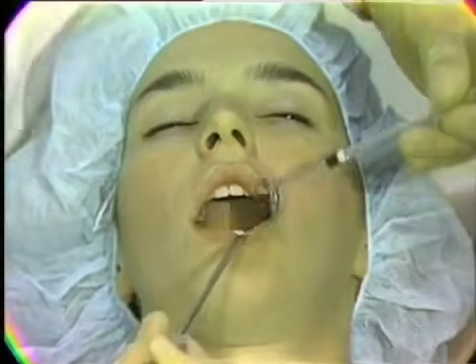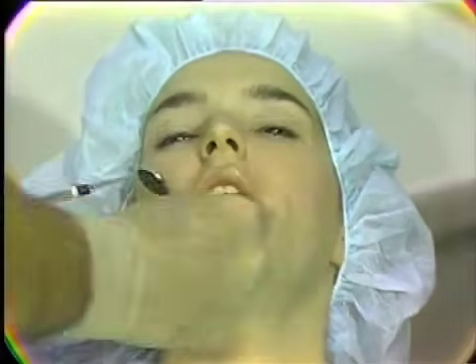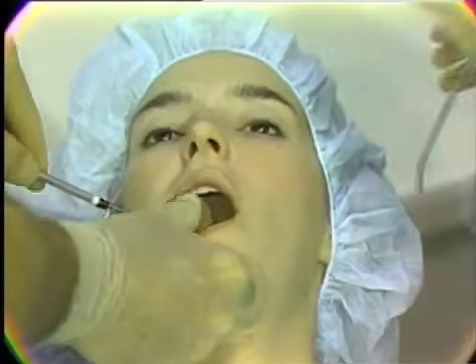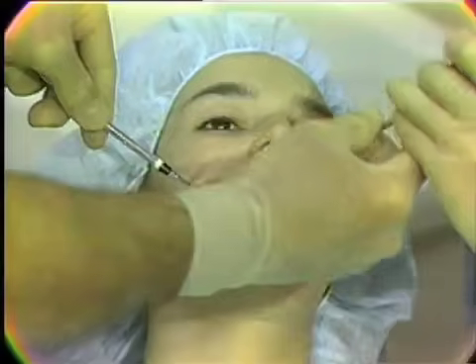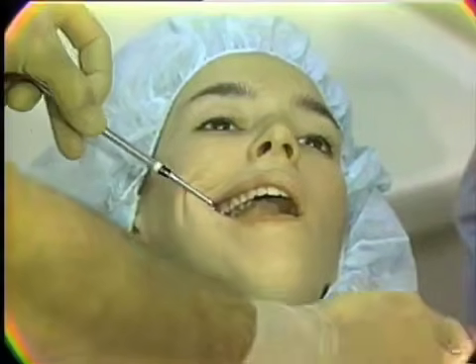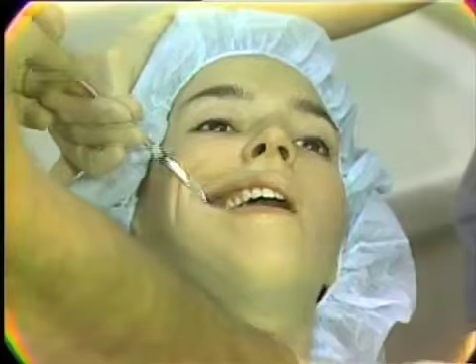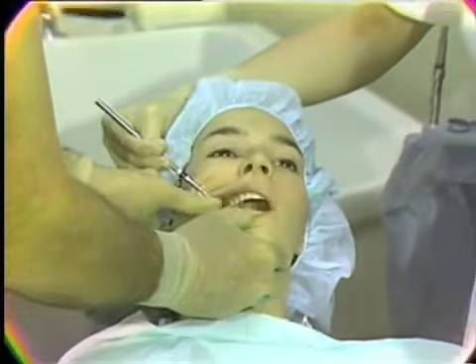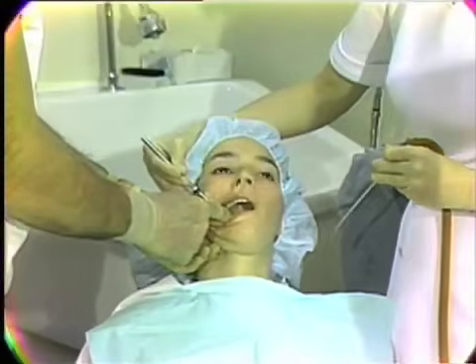We would reverse this situation on the right side. The retraction would be made in this manner. The patient would turn away from the operator. The assistant would reach around behind and take the mirror with her right hand. And in this manner, we could again work directly on this side.